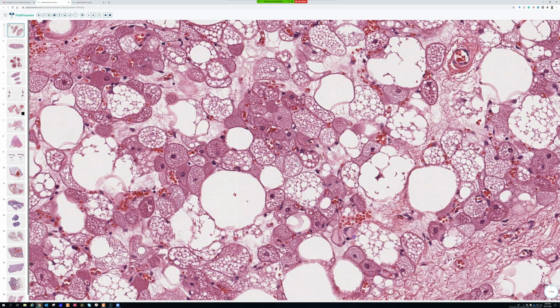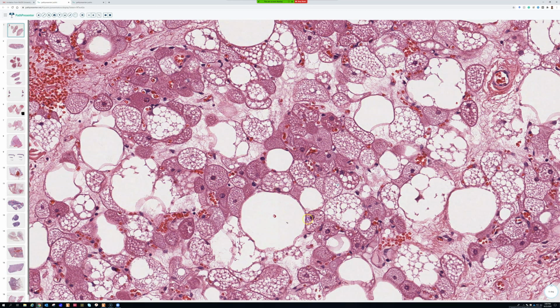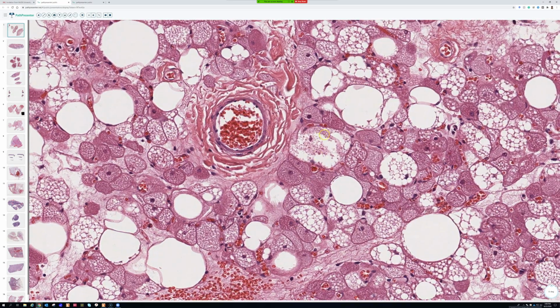And then number 3 are the cells that have this granular pink, reddish pink cytoplasm, in variable amounts. And sometimes you can see a mingling of the bubbly cells with the granules in the background. What are these little granules? Why do these cells look so red and grainy and beautiful?